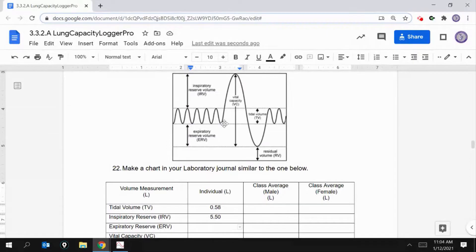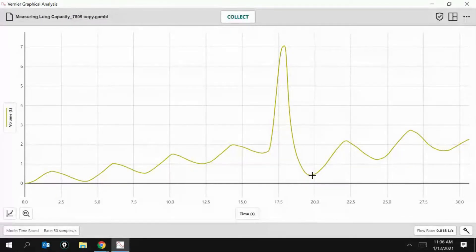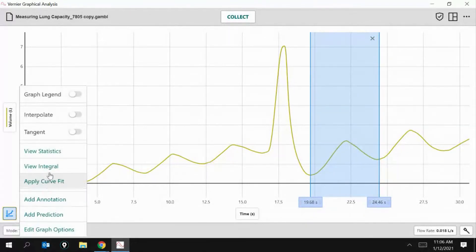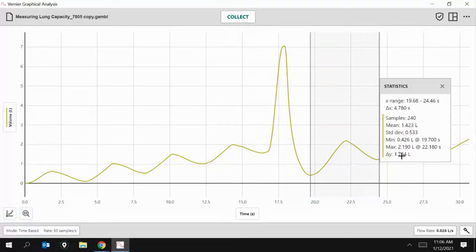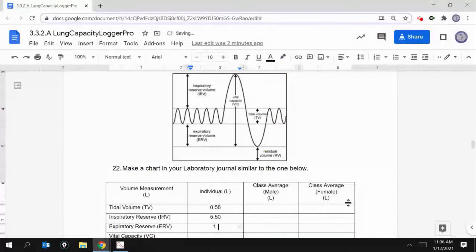Entering 5.50 liters. Now looking at expiratory reserve: it's from the bottom of one of these normal tidal volume breaths down to the bottom of the biggest breath. I'll use the lowest point here, going to the bottom of a normal breath from the two breaths taken after, then hit View Statistics. That gives 1.764 — let's round to 1.76 liters. I'll enter 1.76 in the document.